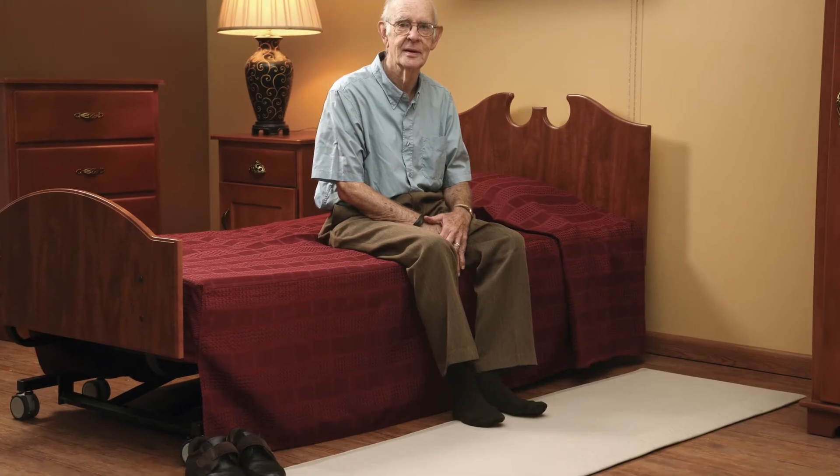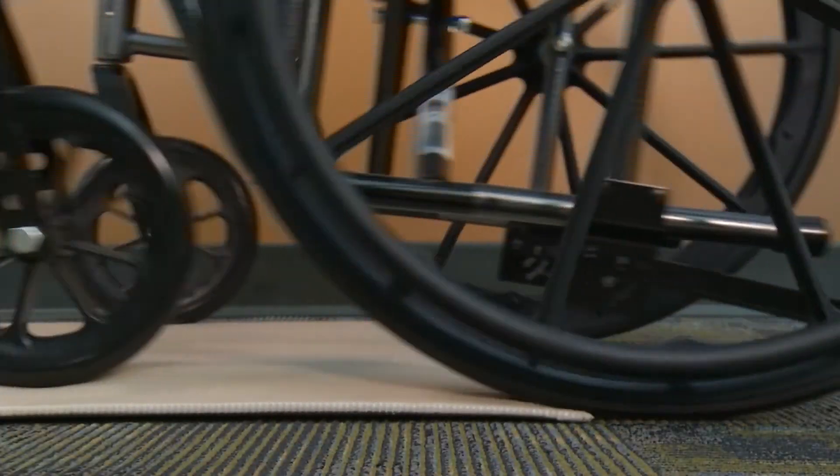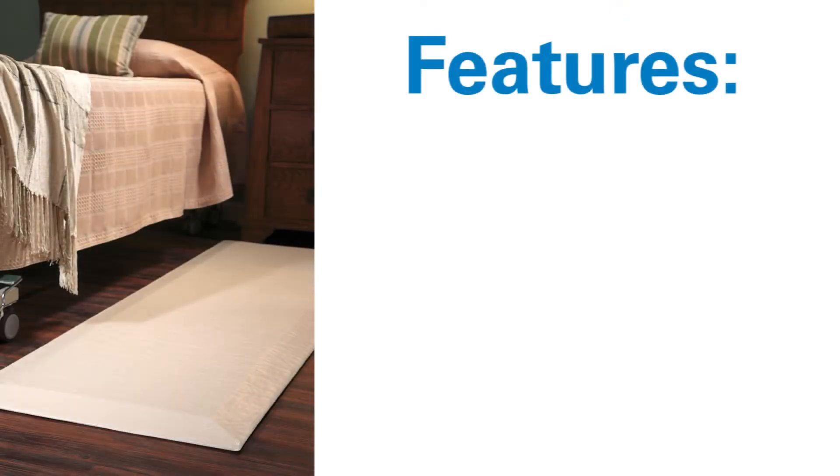With its low-profile one-inch beveled edge, the Protector Bedside Mat lets wheelchairs pass easily over it. The Protector Bedside Mat comes in two convenient sizes, 24 inches wide by 70 inches long and 36 inches wide by 70 inches long.